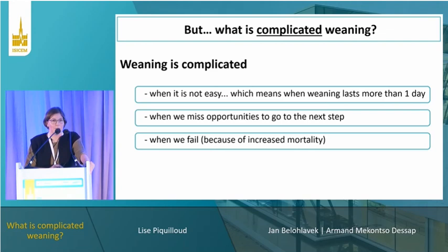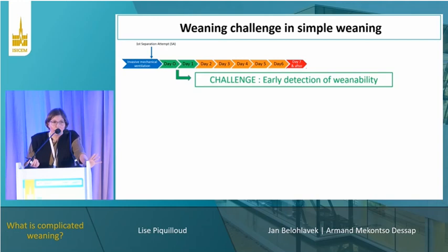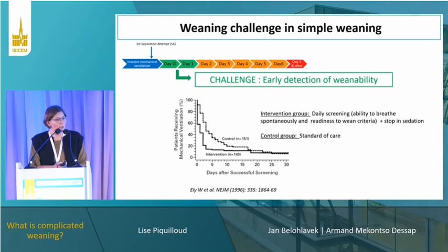Then, how can we do our best to wean our patient? Basically, it depends on where you are in the weaning process. Very early, for the patients that are going to be easy to wean, the real challenge is to detect early that the patient can be weaned. We have known that for a very long time.